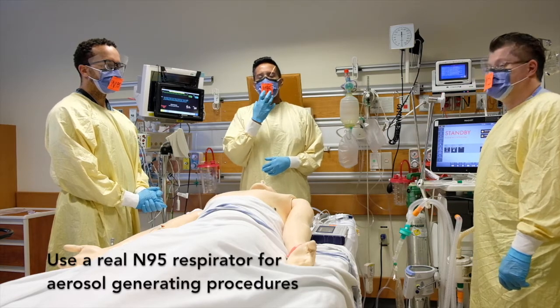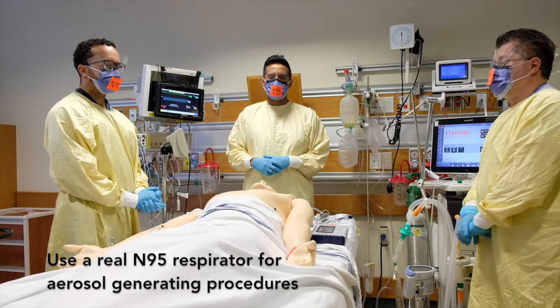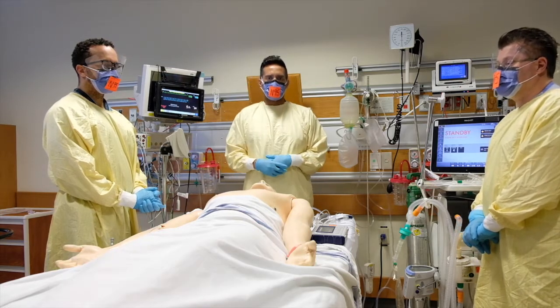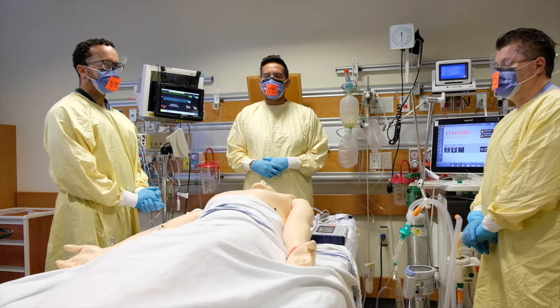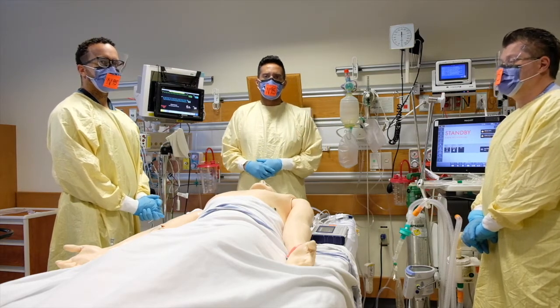And we're all wearing N95s along with a face shield, but due to not wanting to burn precious personal protective equipment, we've just put the sticker on in front to signify that we're wearing N95s. The room is also closed, and we've tried to minimize the number of people in the room.